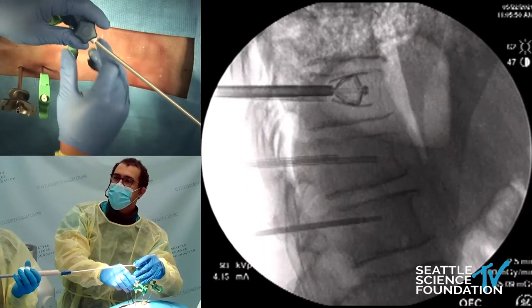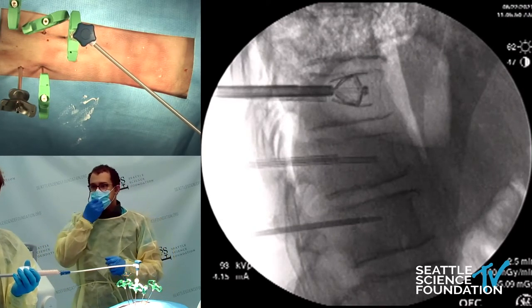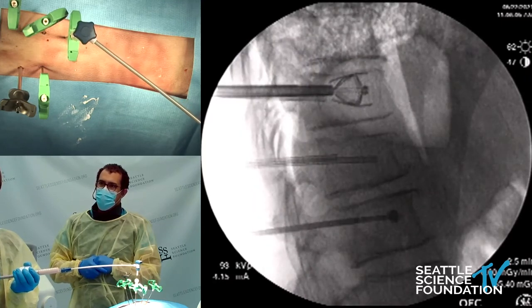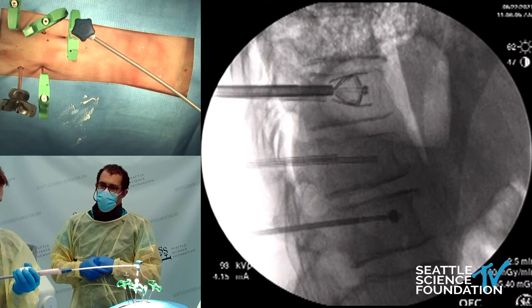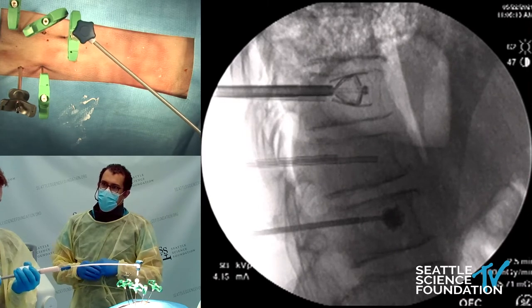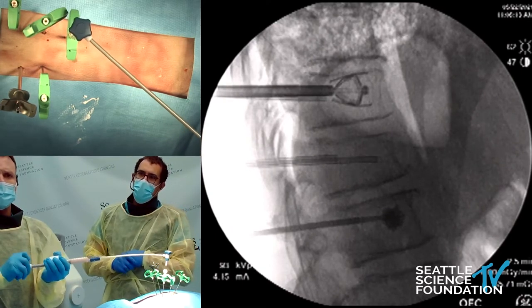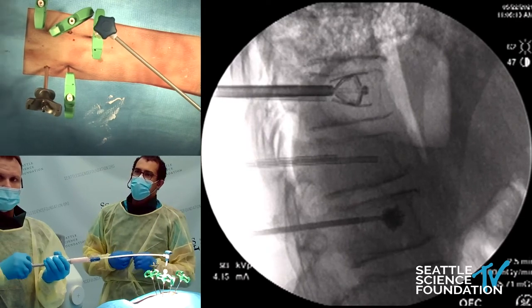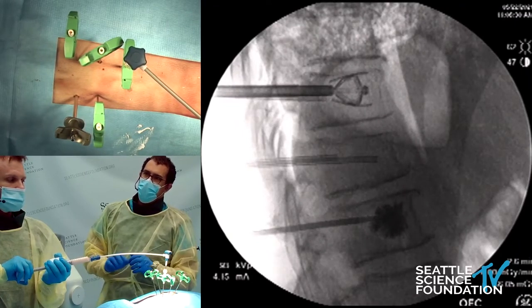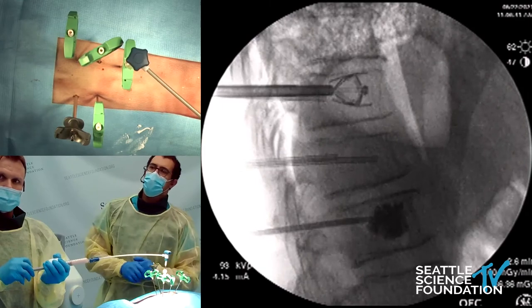You want to get this into the anterior third. We use a lot of fluoro here because even if we didn't violate that anterior body, we want to look for extravasation. Just slowly start cranking that up. You can see it's starting to fill. This cement will tend to transfer back towards the epidural space, so even after you put the cement in, you want to make sure it's very well clear of that posterior third. That's probably enough — it's going to float back because of the venous pressure of the blood.